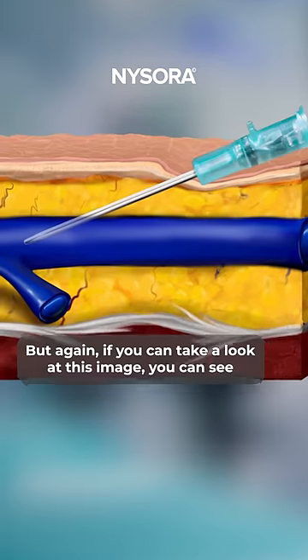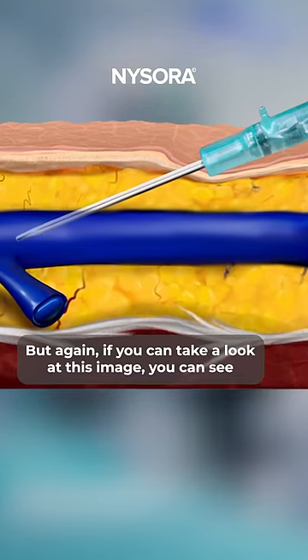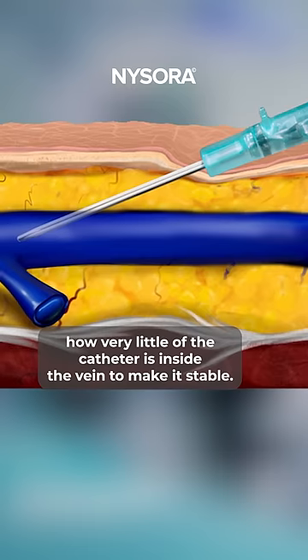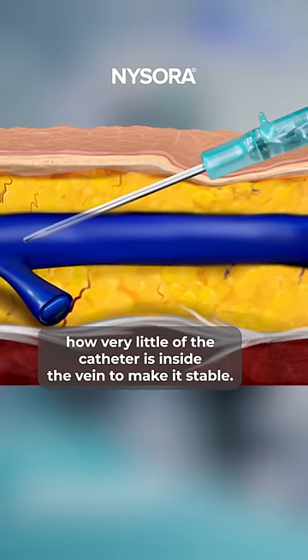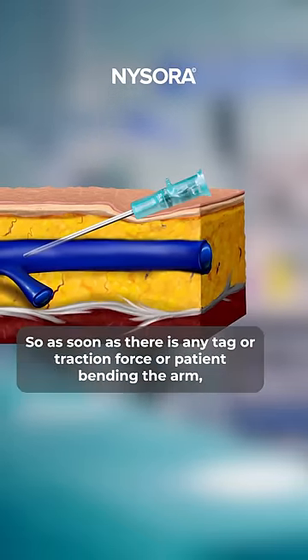But if you take a look at this image, you can see how very little of the catheter is inside the vein to make it stable.